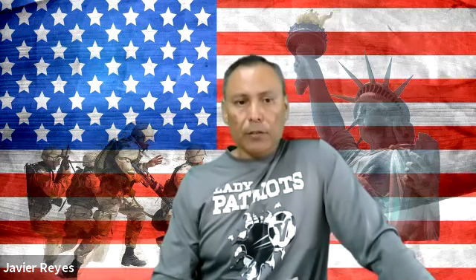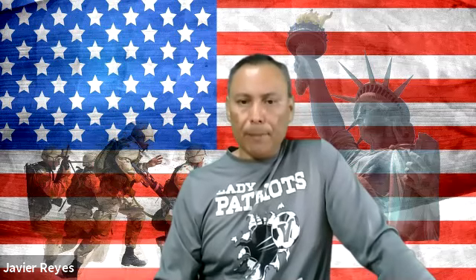Now, time limits. How much time do you have to separate the blood cells from the plasma? I said you have, as a general rule, 2 hours. So from the time you collect your specimens, okay, you have to bring them in within the 2 hours. All right. What happens if you don't bring them within the 2 hours? What could possibly happen?